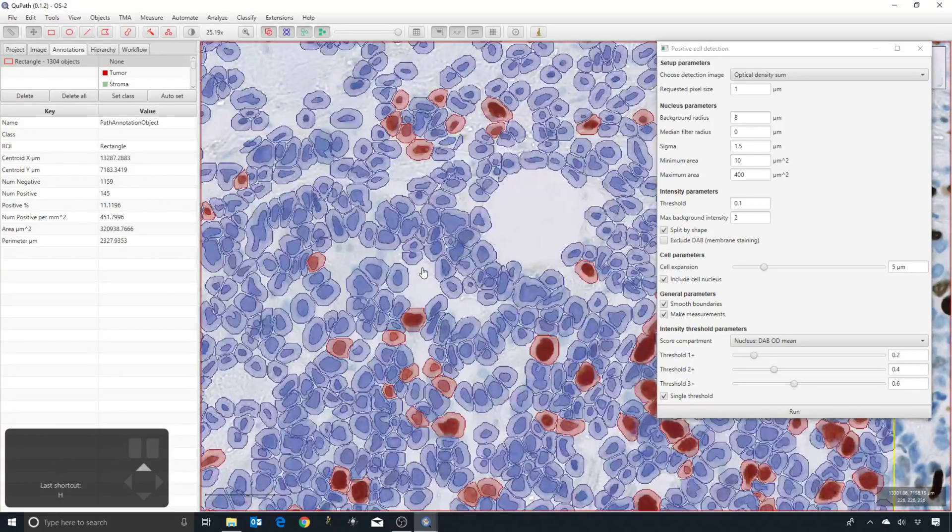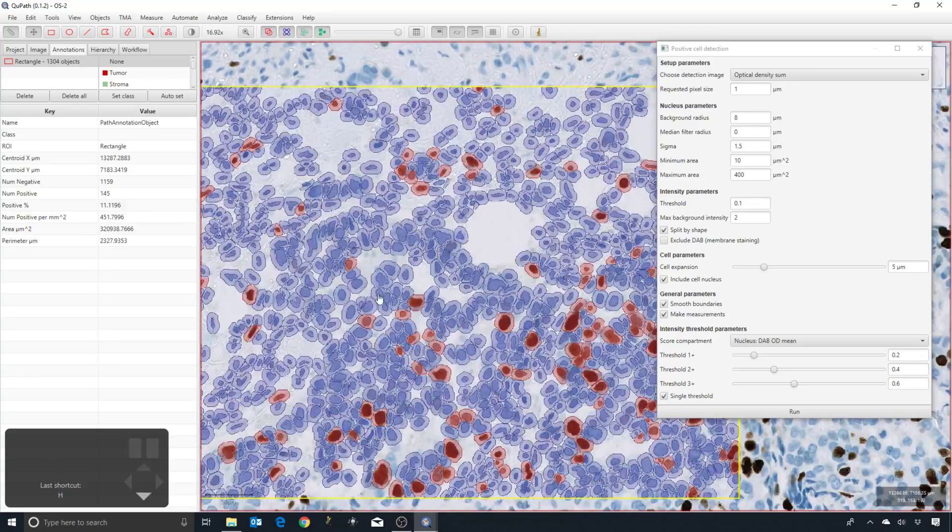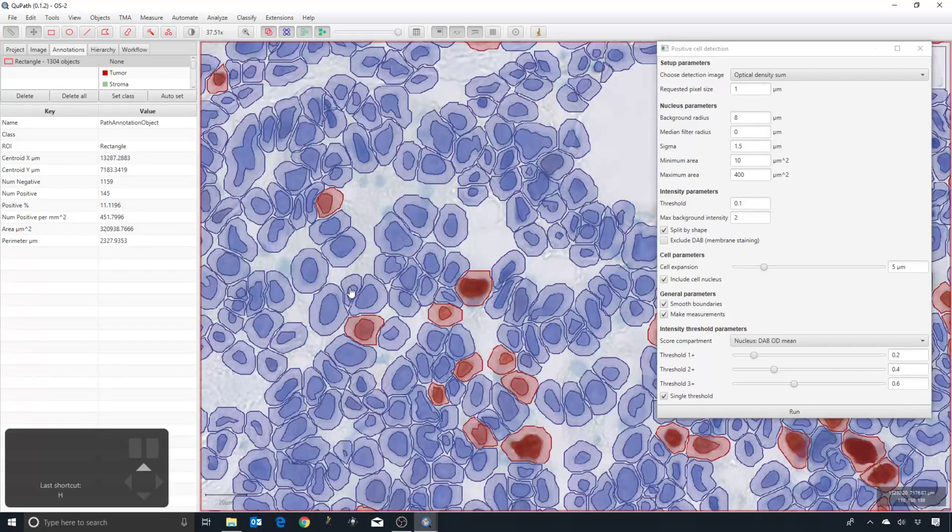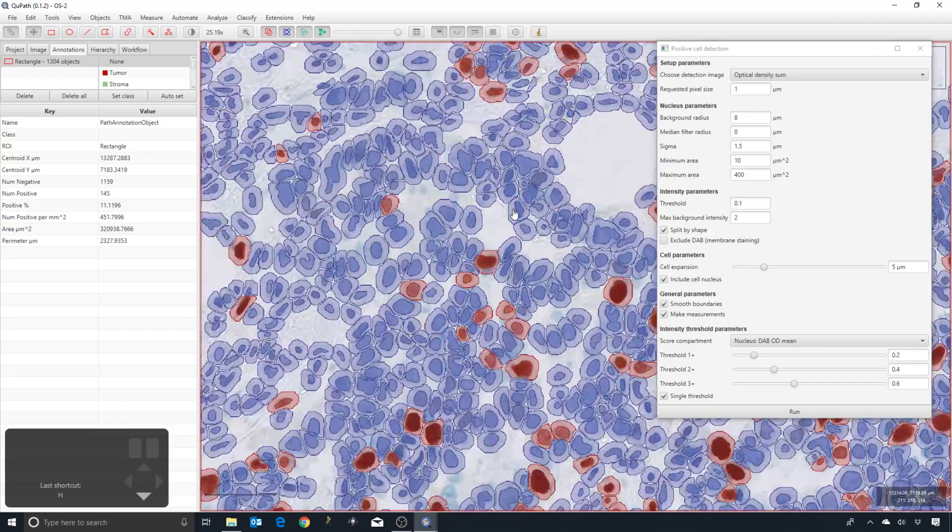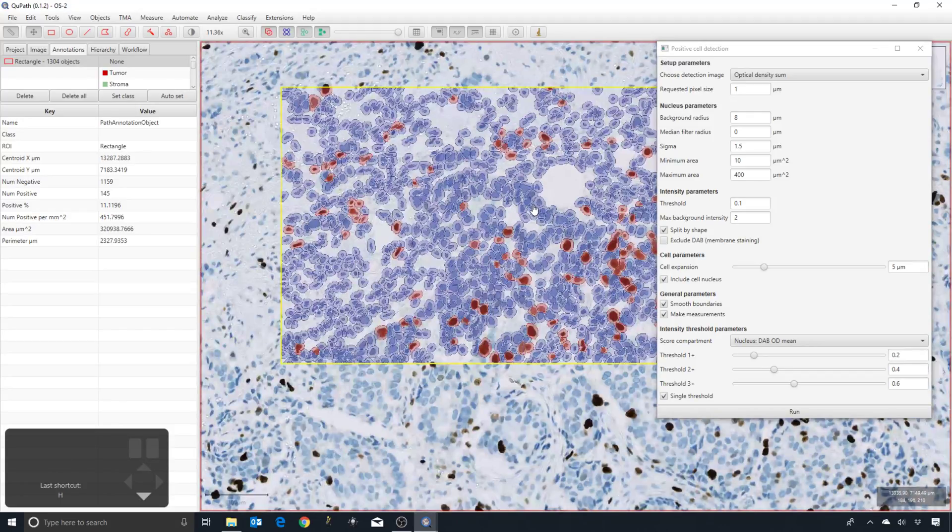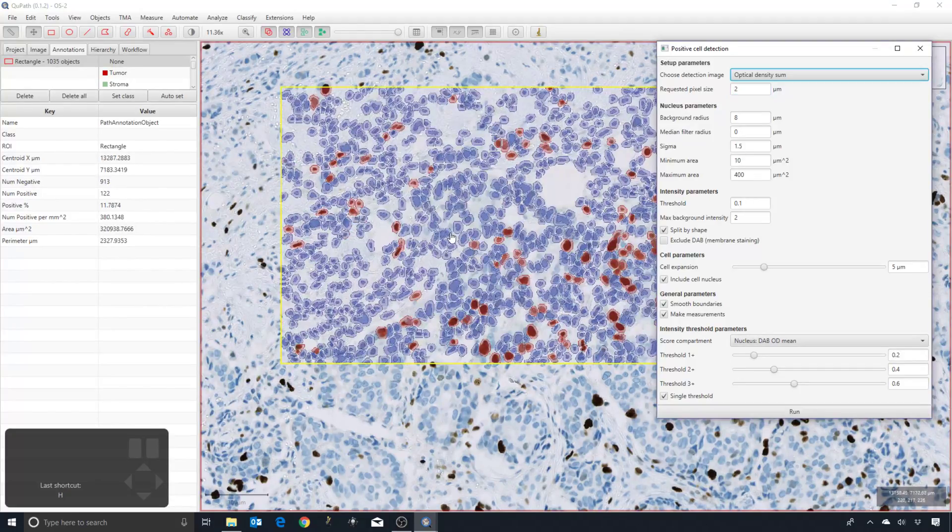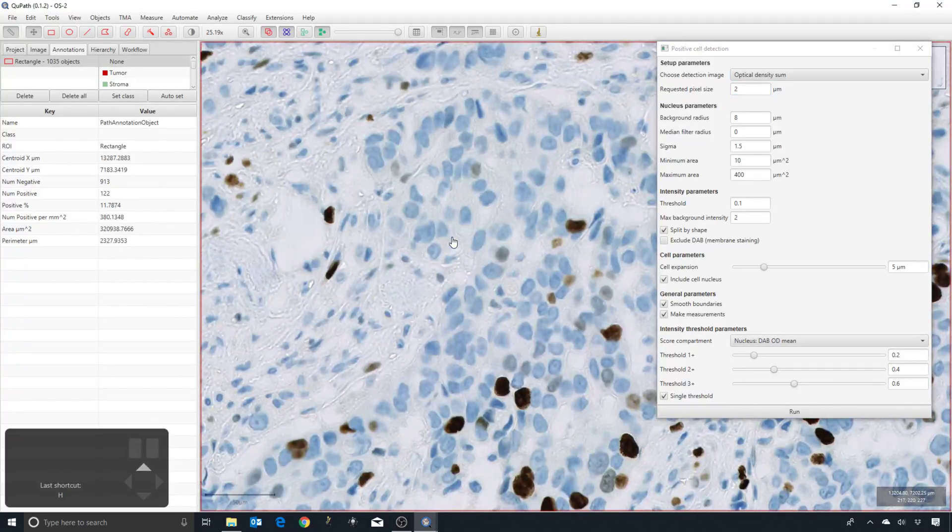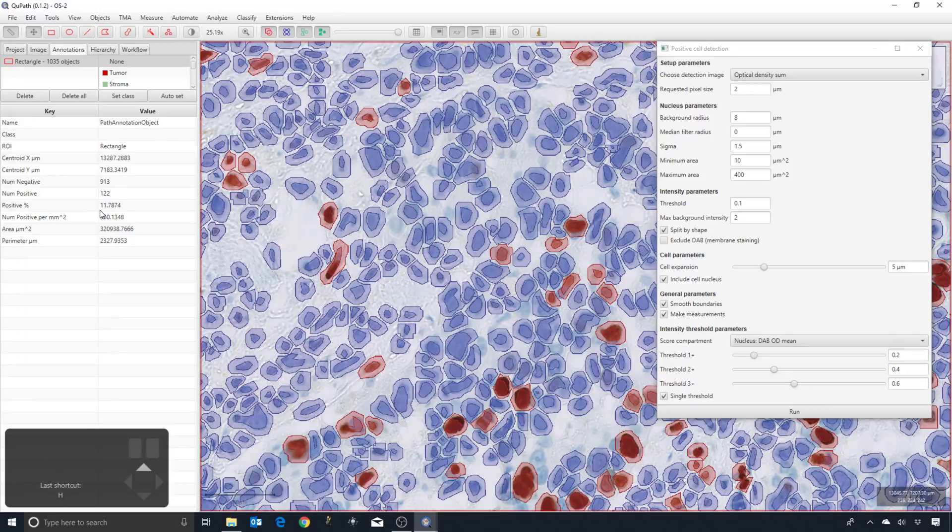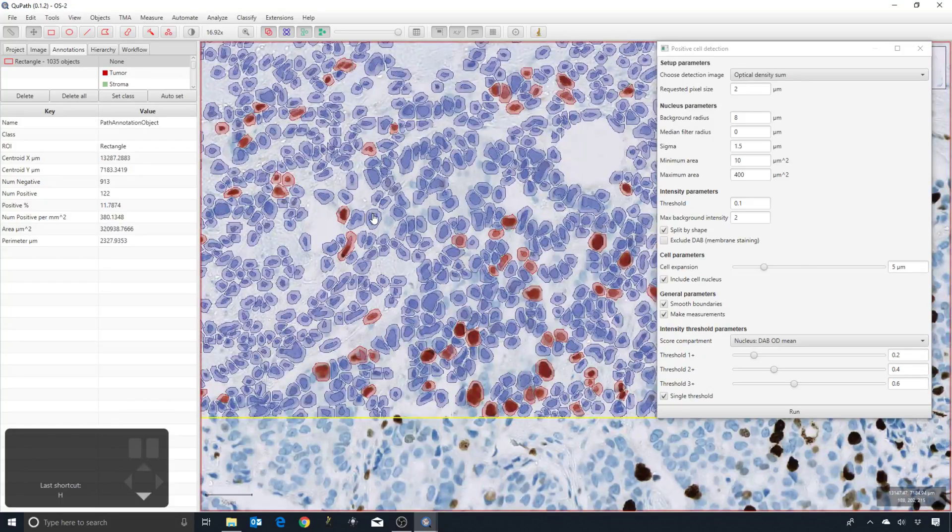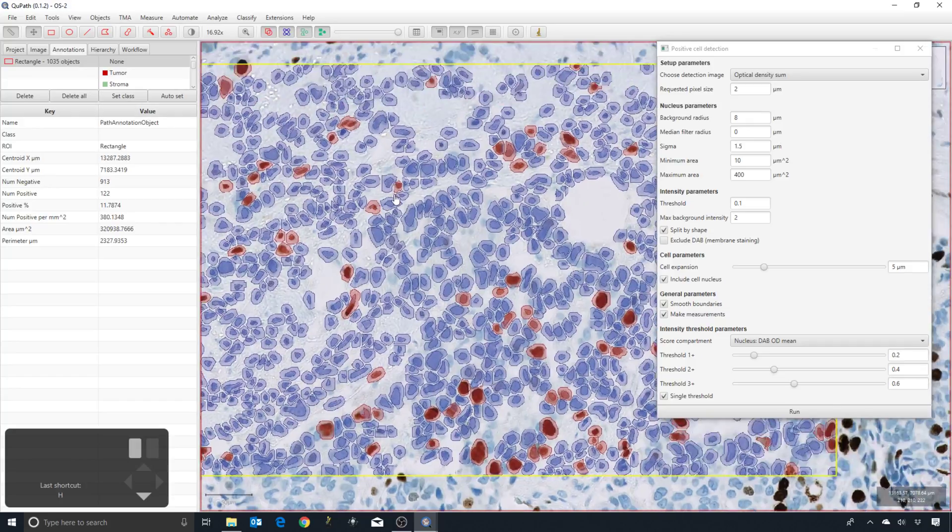You might see the contours of the nuclei are maybe slightly less convincing, but still very similar results. I'll double it again, and now you really start to see a big difference. The positive percentage is about 11.8%, so it's still about 1.5% difference from running at the full resolution, less than 1% difference in absolute terms compared with running at pixel size of 0.5.